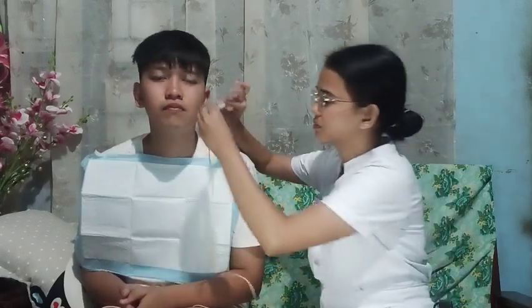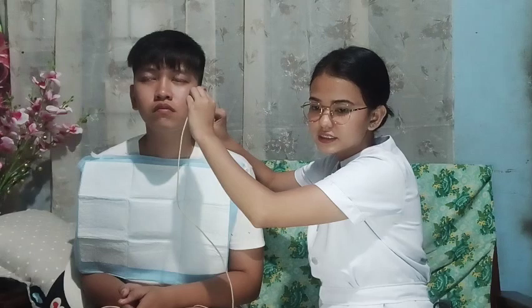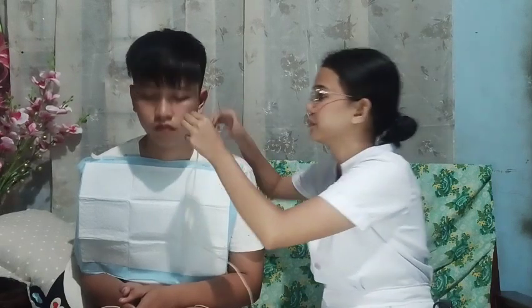I will now flex the client's head forward, and then tilt the tip of the nose upward, and pass the tube gently into the nose as far as the throat. I will guide the tube. Okay? Kunwari, na-insert ko na siya, hanggang nasopharynx. Once the tube reaches the nasopharynx, allow the client to lower his head slightly. Okay, lower your head po.